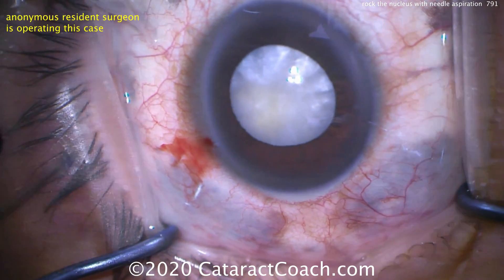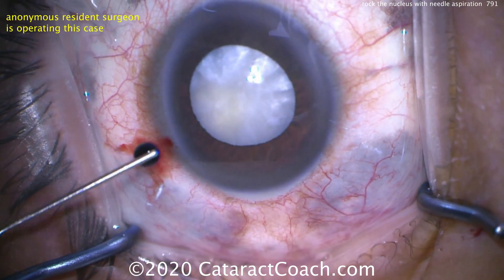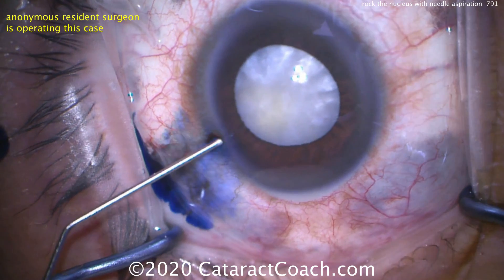Here's the cataract. You can see it's milky white. It's intumescent, so it's fluid-filled. The cortex has liquefied.